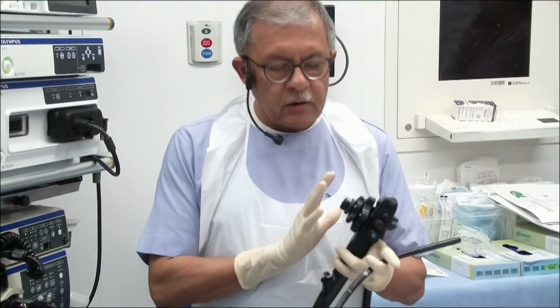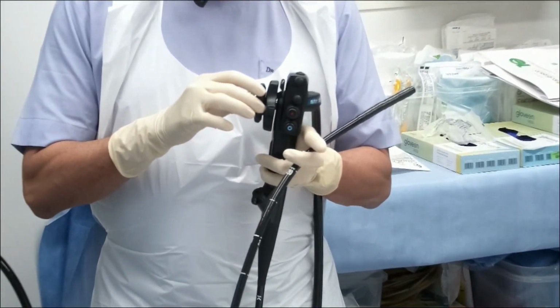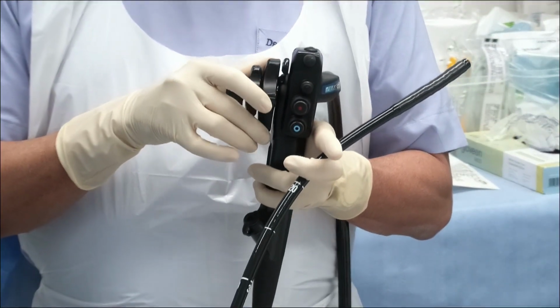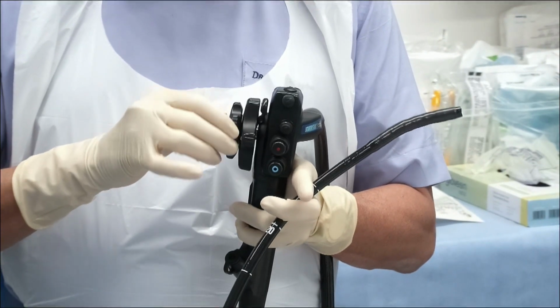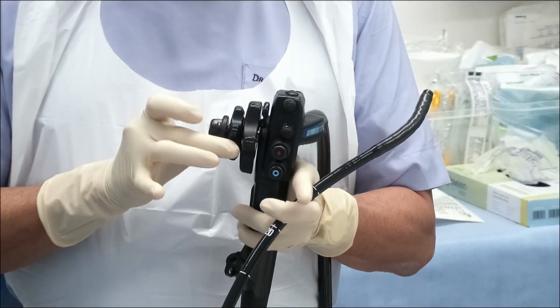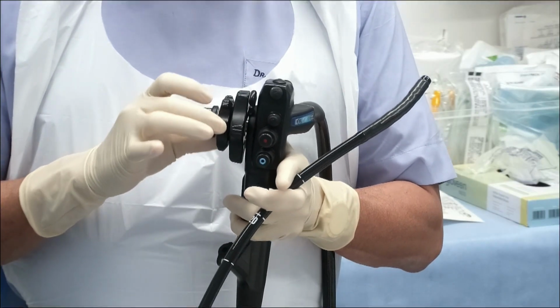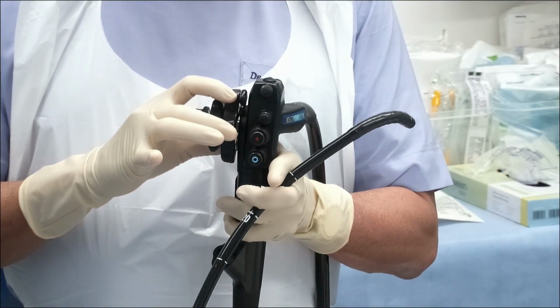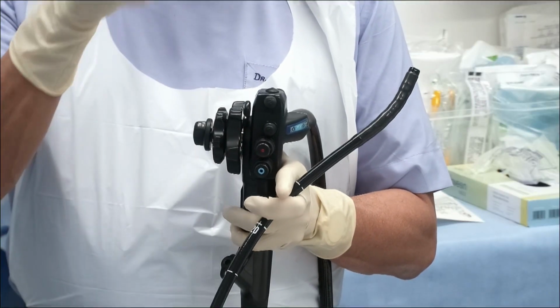Now, if you look at the control body over here, you have 2 wheels: one small wheel and one big wheel. When you turn the small wheel towards us, that is up, the endoscope tip turns to the left. When you turn the small wheel ahead in the front, the endoscope tip turns to the right. Whereas with the big wheel, when you turn it towards us, the endoscope goes up, and when you turn it away from you, the endoscope goes down.